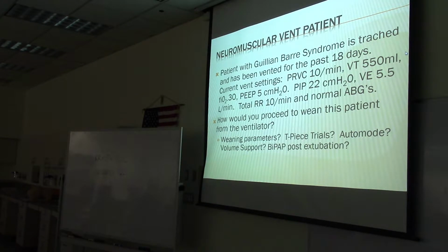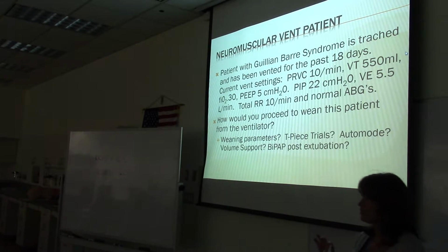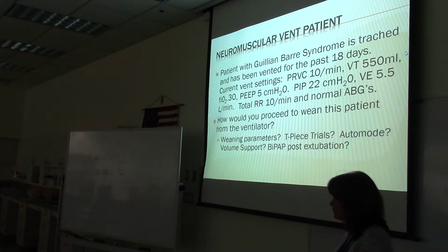Auto mode, is that a good idea? Remember, with auto mode, you've got a full support mode and a CPAP pressure support mode. And if the patient's breathing spontaneously, they'll stay in the spontaneous mode. Or if they have a period of apnea, they go back to full support. That'll be to be safe. Good. To be safe?